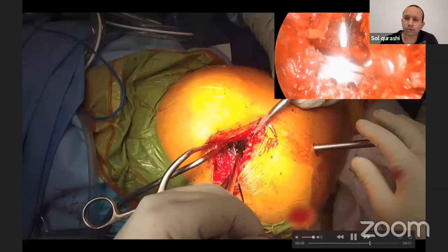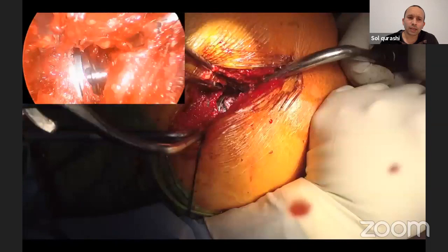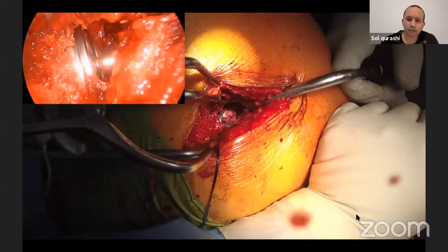And that's done under direct vision. So you can see the posterior wall completely. You can see how far you're going. You can see how much you've got left. Once you're happy with whatever you've reamed, you put in the definitive cup.